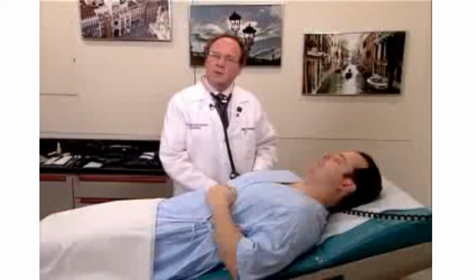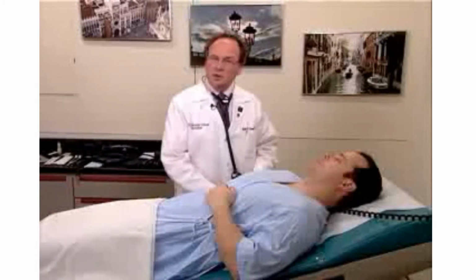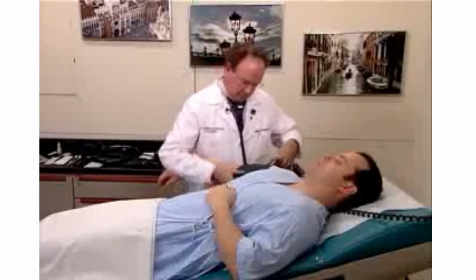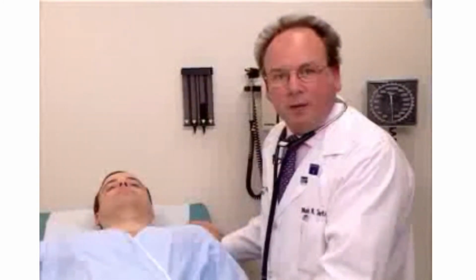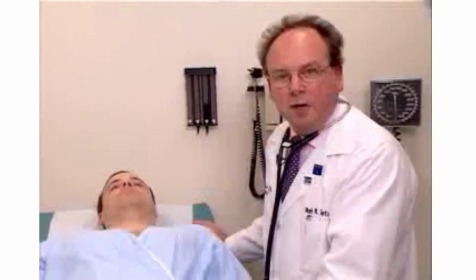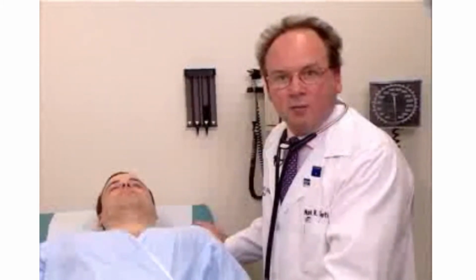After blood pressure determination in the right arm, we're now going to do blood pressure by auscultation in the left arm. We're now going to proceed with blood pressure in the left upper extremity. We only have to do blood pressure by auscultation since we already know what the peak systolic pressure is.